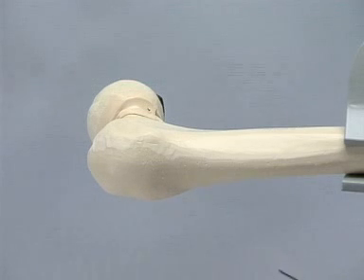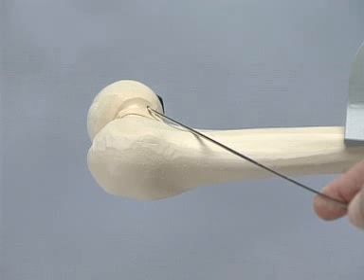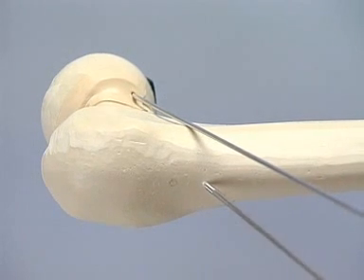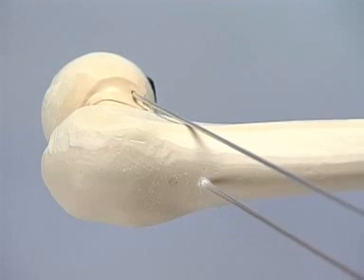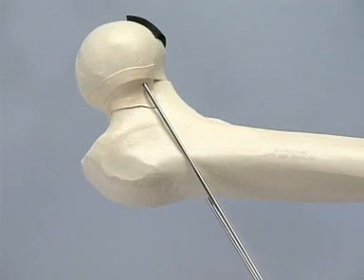A K-wire is introduced anteriorly along the femoral neck in order to indicate the anteversion and overall direction of the planned screws. The first 2.8 millimeter guide wire is then introduced parallel to the orientation wire, and its position is checked under fluoroscopy. If the first wire in the head and neck is correctly positioned, the orientation wire may be removed.